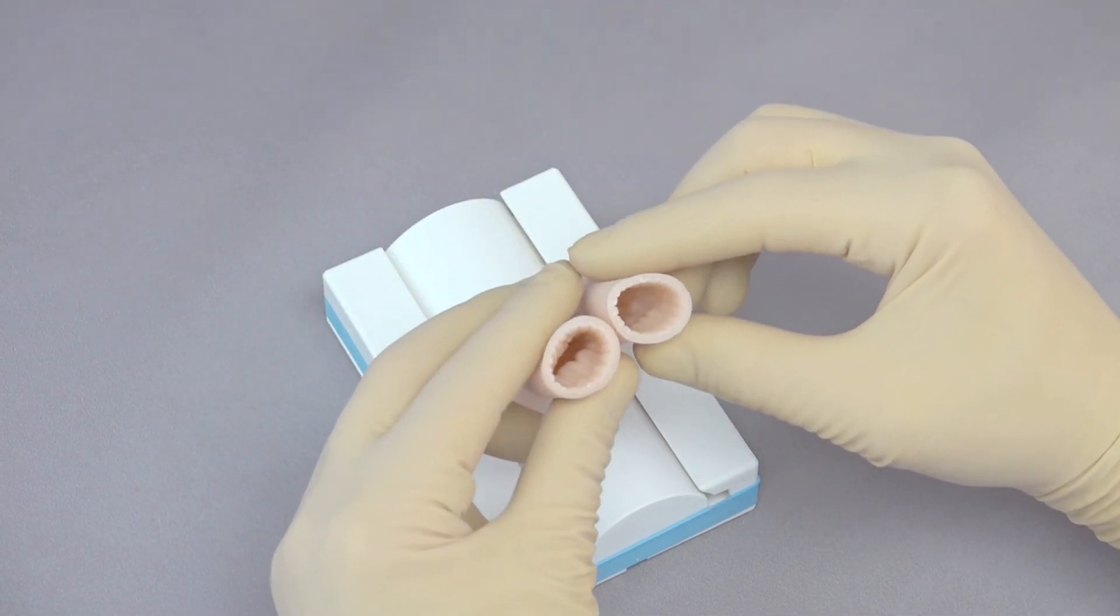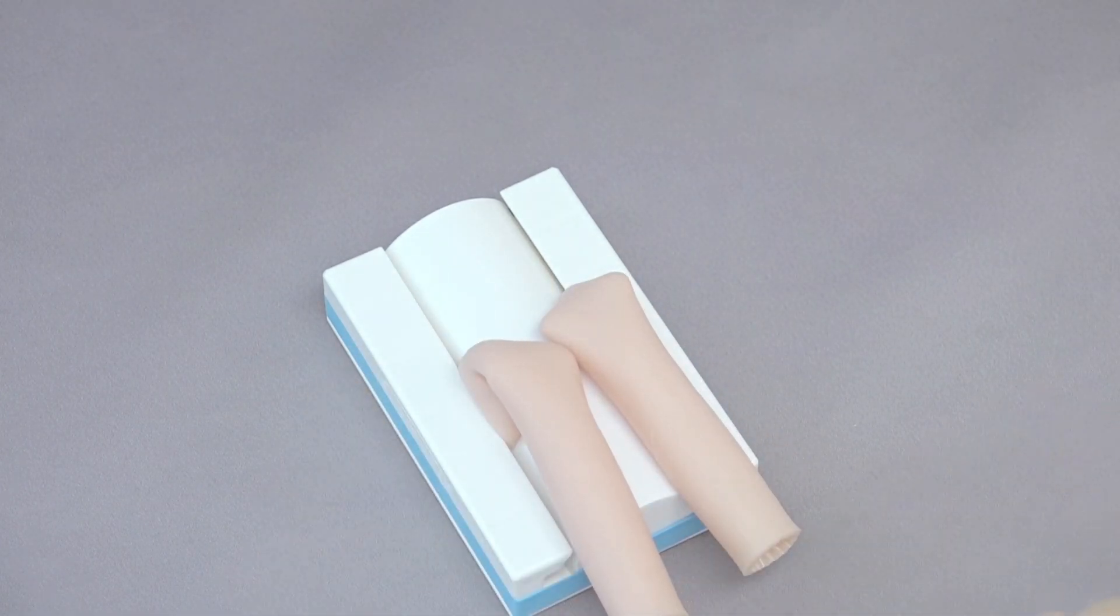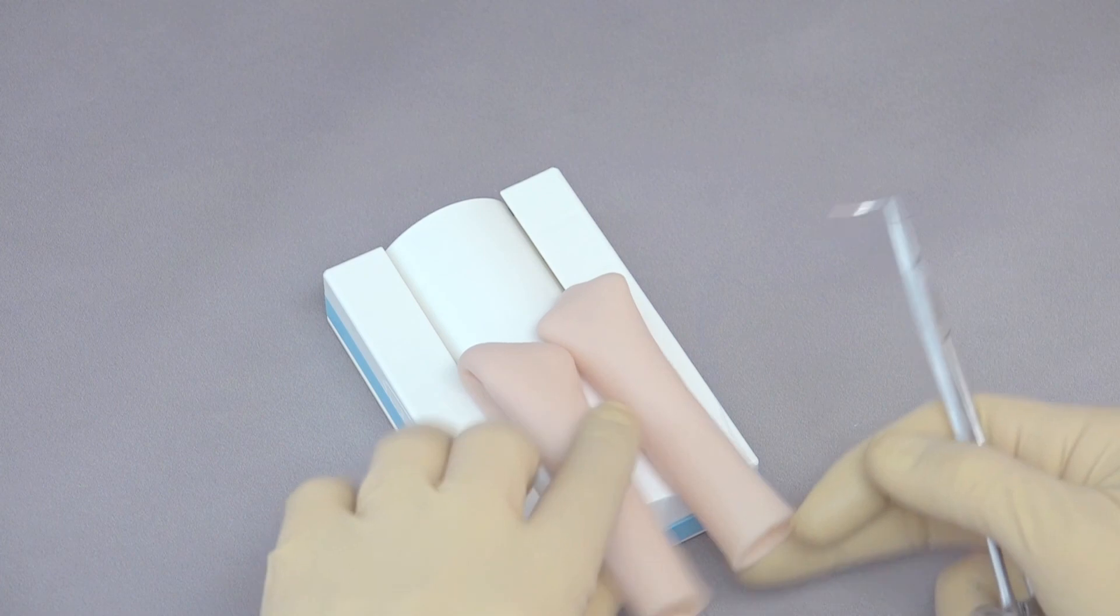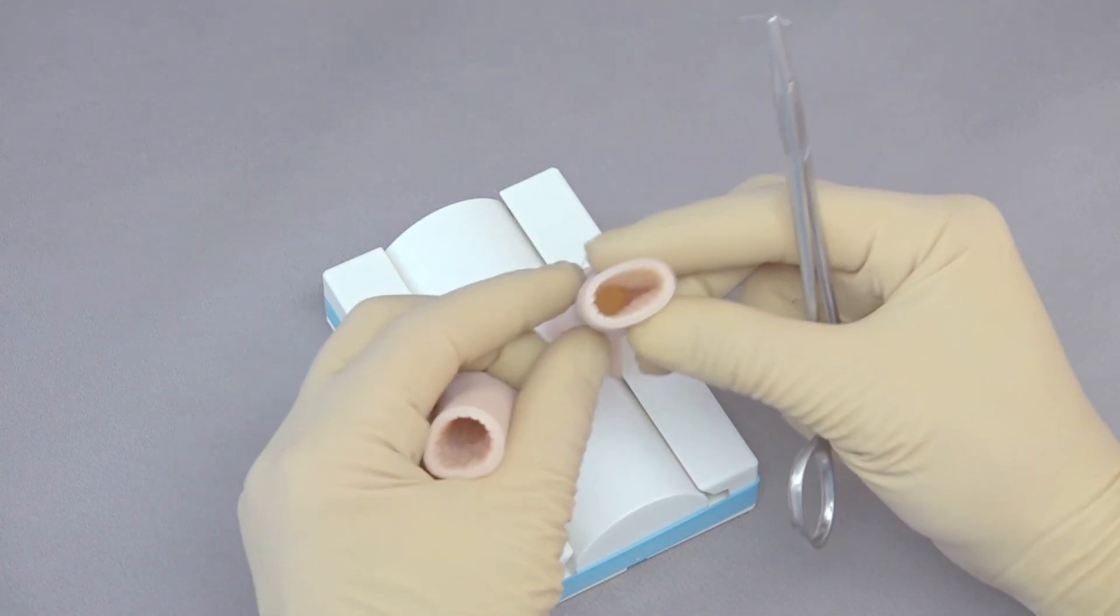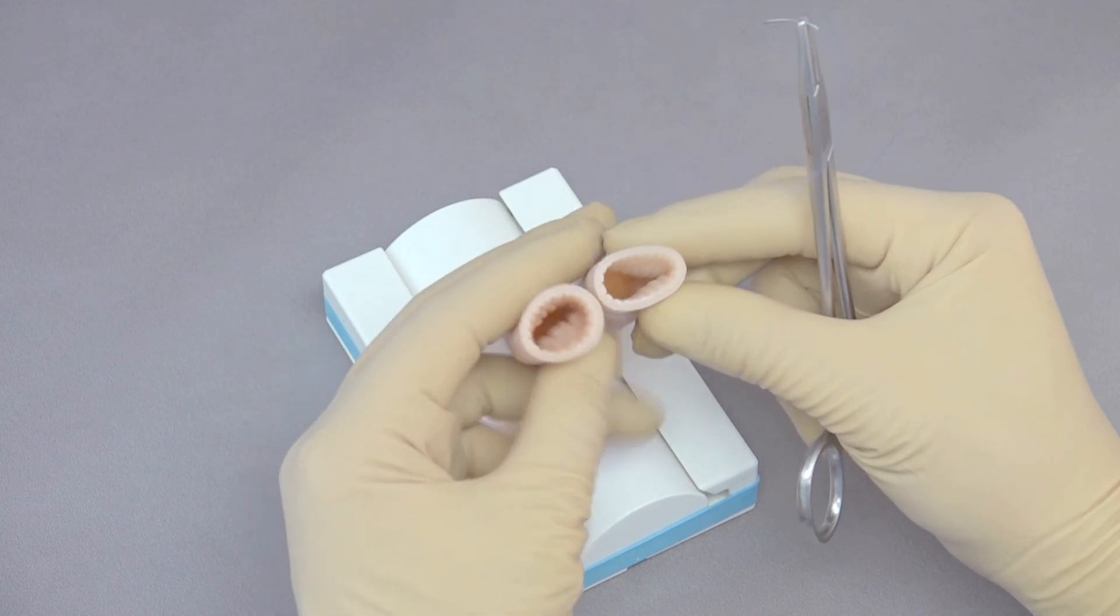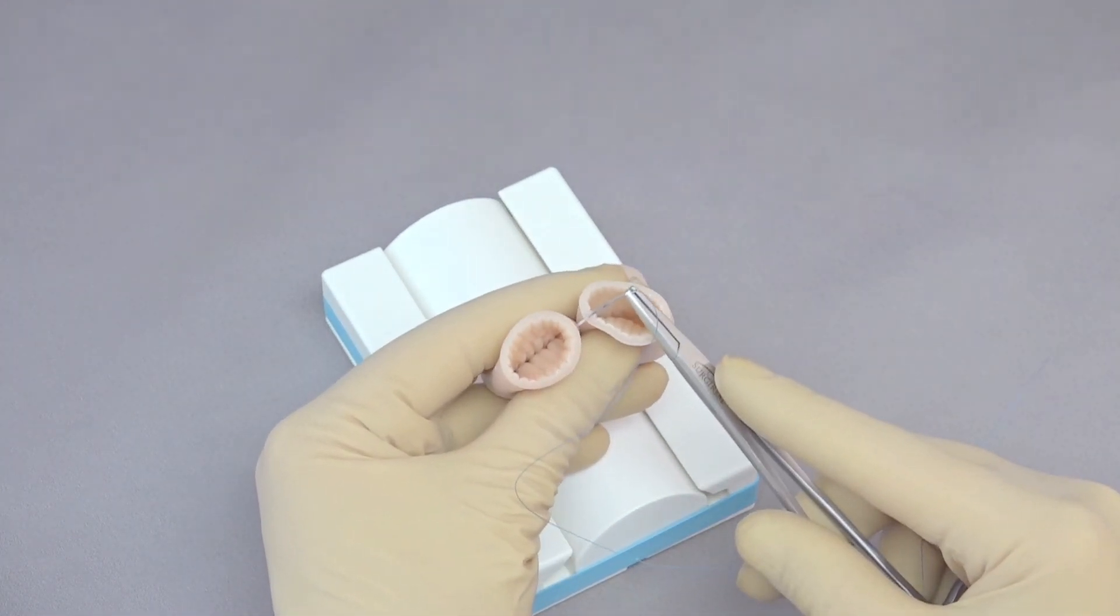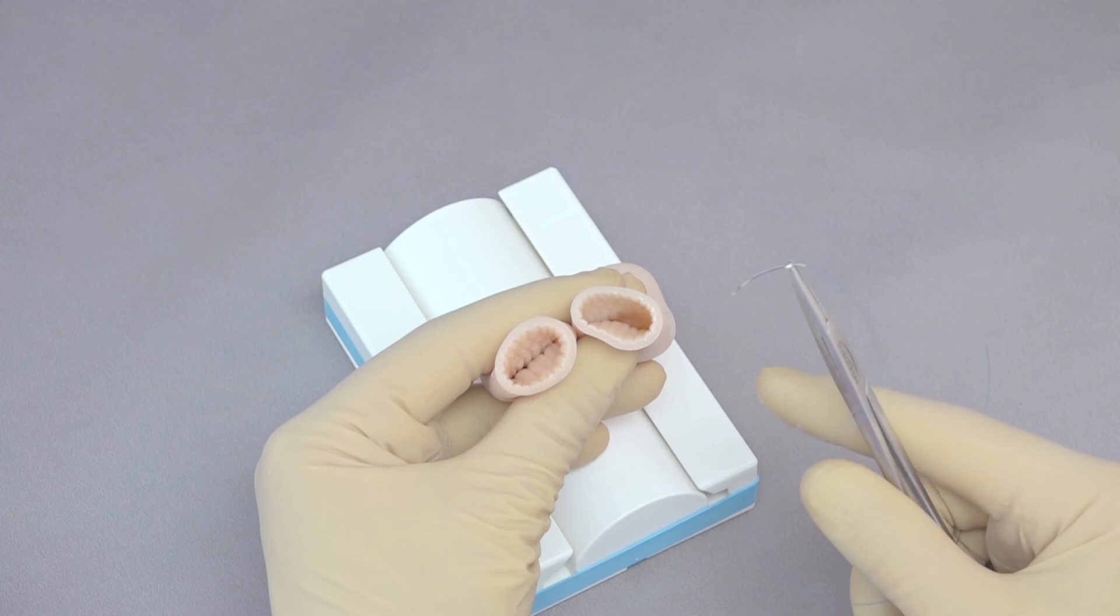Now the best way to do an intestinal anastomosis is to actually do two lines of suture material, one from the mesenteric surface to the anti-mesenteric surface and then another the other direction. In this case we're going to start on the mesenteric surface. I'm going to place the suture using some 3-0 monofilament non-absorbable, though typically you'd use an absorbable suture for this.